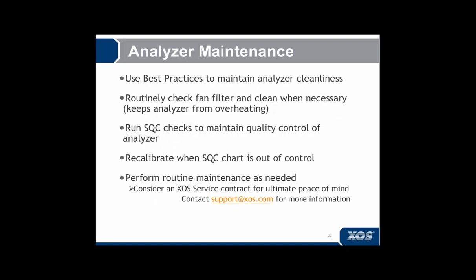Next, let's talk a little bit about analyzer maintenance. Just some simple things to help you get good measurement results. Using best practices, maintain analyzer cleanliness. You'll also want to routinely check the fan filter in the back of the analyzer and clean that off when necessary. That will keep your analyzer from overheating.